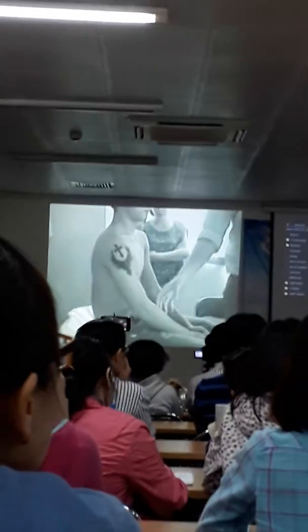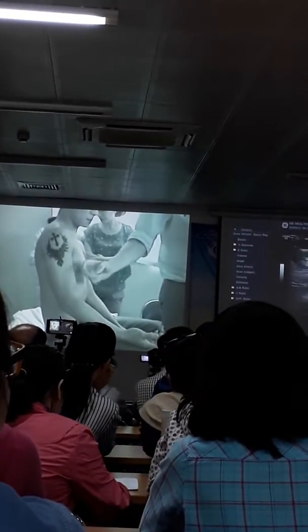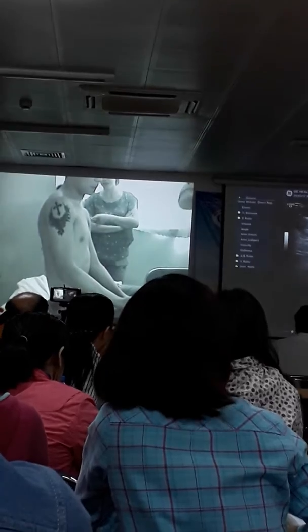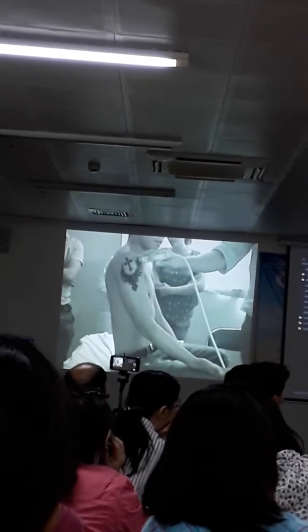So as I said before, I start off looking at the long head of biceps. So I just get the patient sitting up nice and straight. Bend their elbow a little bit and just put their hand on their thigh. Starting off in a transverse plane.